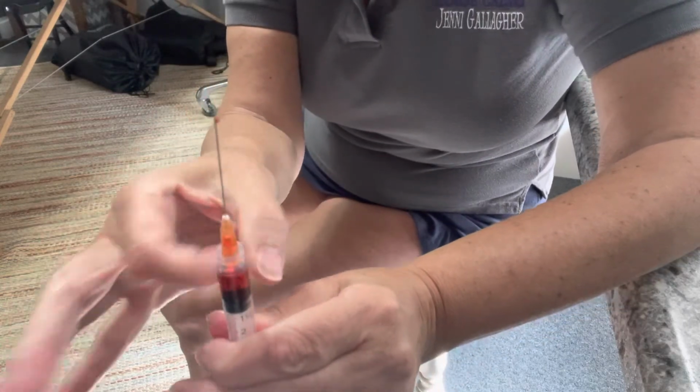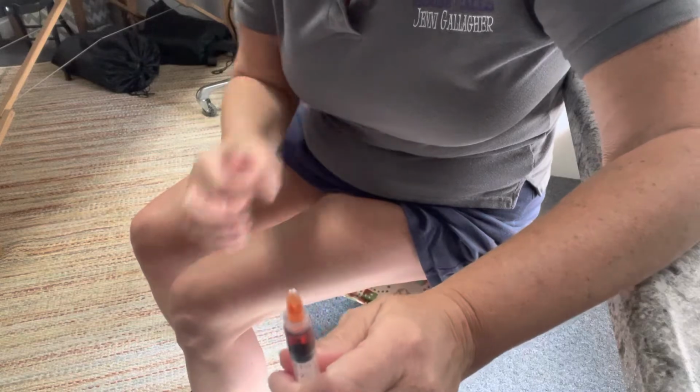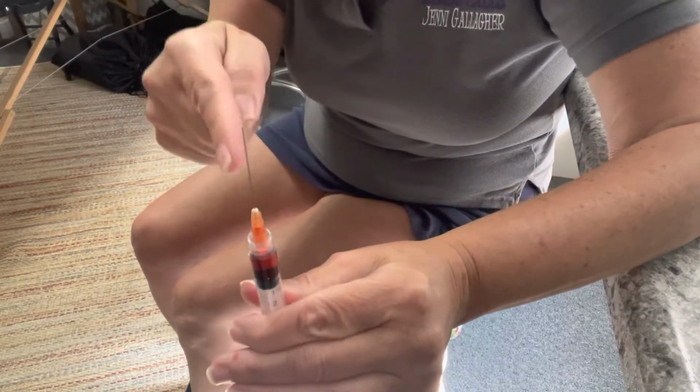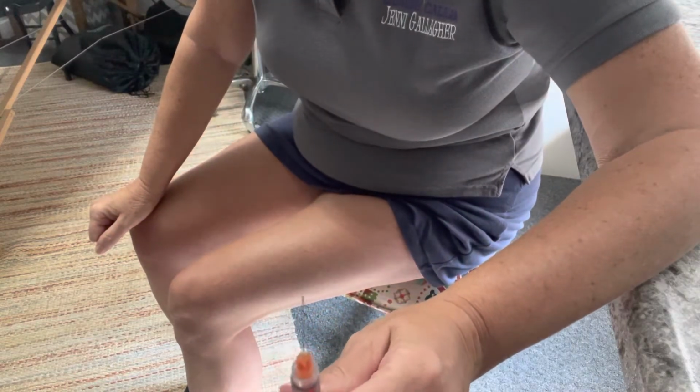You can flick it a little bit. You have to be careful with that. If you're not holding it securely, you can flick the whole syringe right out of your hand. So it's not something I recommend. I prefer to draw the air back out of the pathway and then inject till I see that little dot of medicine at the top.